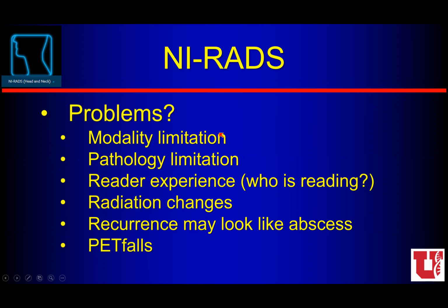Now, I personally had some problems with this. One was the modality limitation. Not everybody's got a PET CT, and not everybody uses it the way that these people do who are doing NI-RADS routinely. I wanted it to be modality independent and pathology independent, but I kind of got shot down on that. And obviously it's a big deal with reader experience.